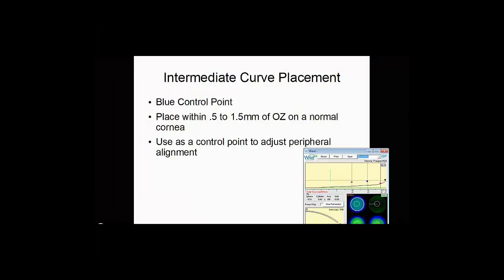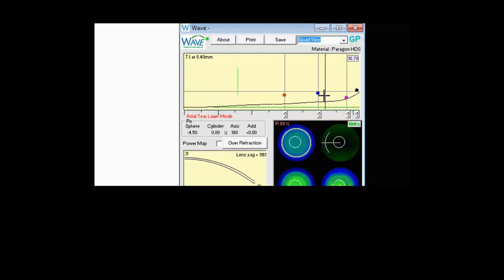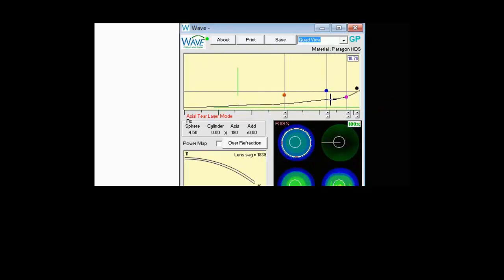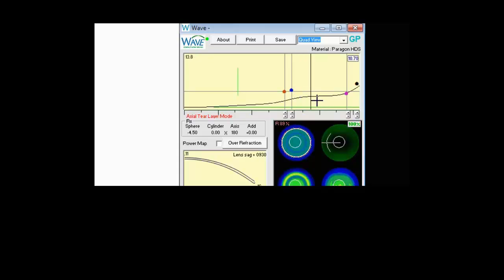Next we have the intermediate curve placement. This is the blue control point. I suggest you place this within a half millimeter to one and a half millimeters of the optic zone on a normal cornea. Use it as a control point to adjust the peripheral alignment. In our lens, this area between the blue and the pink dot is our peripheral alignment control. If you place the IC out too wide and you want more peripheral alignment, you're not going to have a lot of space. If you bring it in closer towards the optic zone and you want to adjust it, you'll have a lot more room to do that.